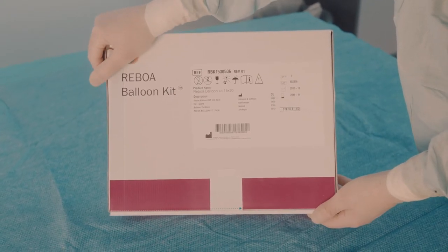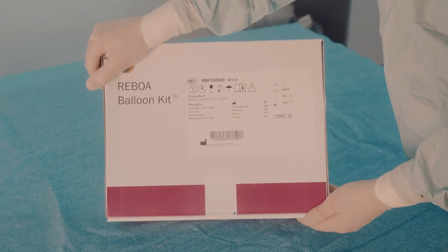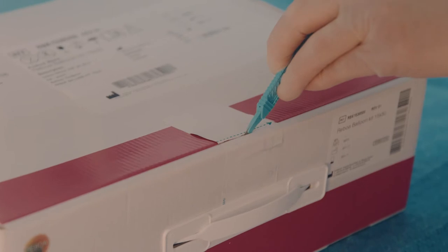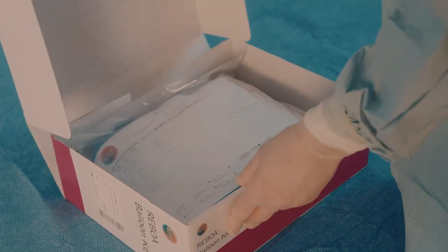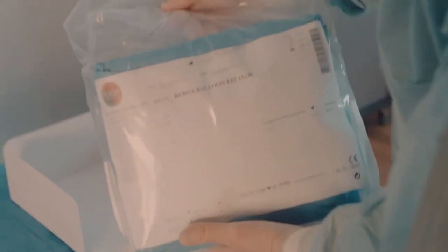The Reboa Balloon Kit is a complete kit that contains all that the trained physician needs to achieve temporary occlusion of the aorta, except fluids. It is important that the performing physician has read the IFU, Information for Use, before use. On top of the package, the kit with sterile draping, needles, syringes, and the other devices needed to support the procedure are located.